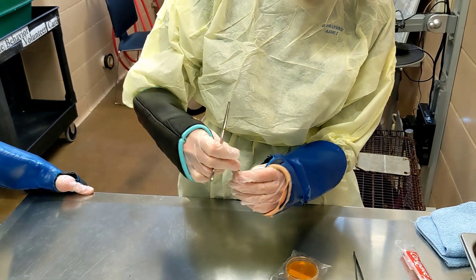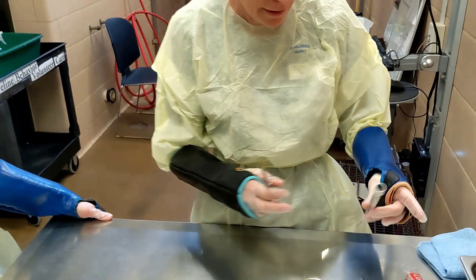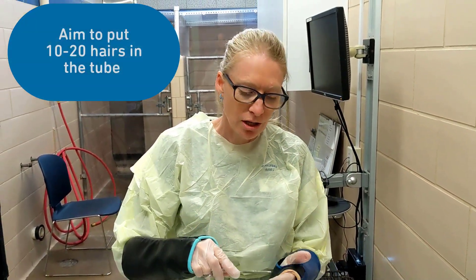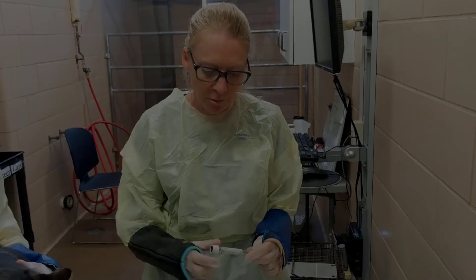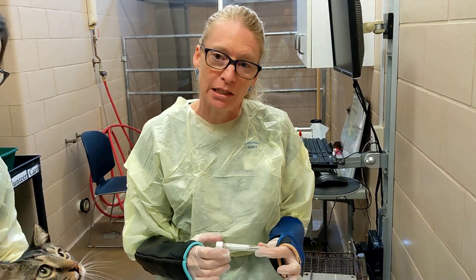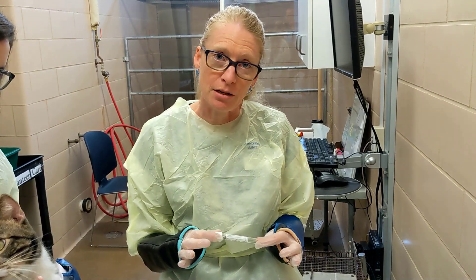We'll probably need to get a few more hairs — there's just a couple in there — so we'll do another pluck just around that lesion. You want to get as close to the skin as possible, pluck out, and get some of those hair roots. One more thing about the PCR: just label your tube so we know what it is. You're going to send this out for IDEXX ringworm PCR testing.